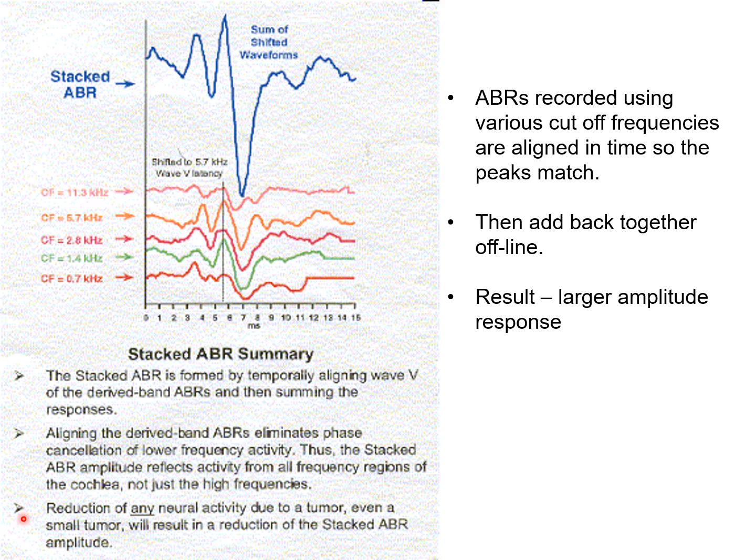So if I put it in layman's terms, now we have a very big amplitude. So it's going to be more sensitive and easier to identify when there is a reduction in amplitude, because it's so big now. When we have any pathology such as a tumor, that will cause amplitude decrement, and that will be easily identifiable because now we have a big amplitude response.